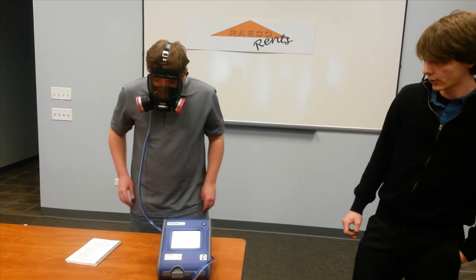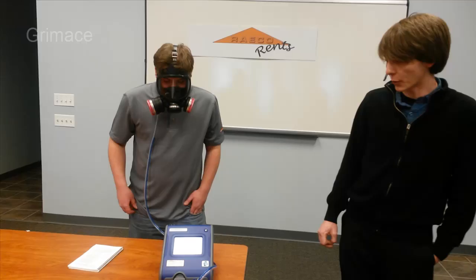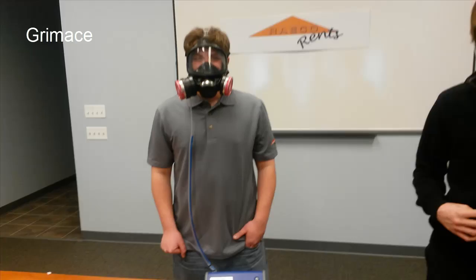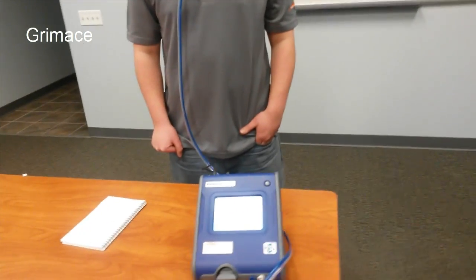Once it finishes, it's going to have you do a grimace. You can just make a snarling face or a disgusted look, something like that.